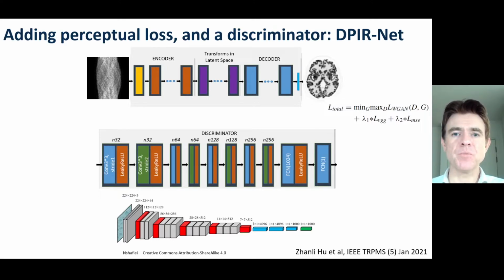And so the discriminator is actually trying to learn to catch out this generator network. This reconstruction network is trying to generate high quality images, but the discriminator is being trained to say whether or not this is actually a good reconstruction. And so these two are actually in opposition. This is trying to get better and better at generating realistic looking images, whereas the discriminator is trying to get better and better at figuring out whether it was a reconstructed image or an element of the training set. And so this discriminator is basically a way of enhancing the loss function.